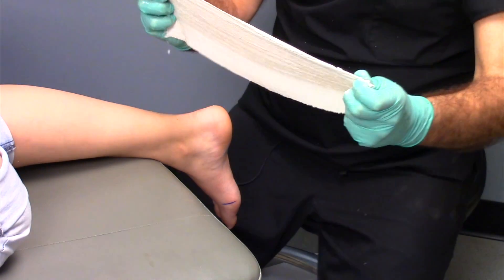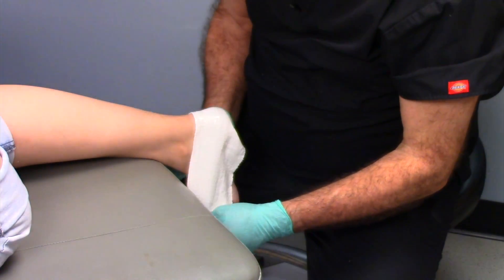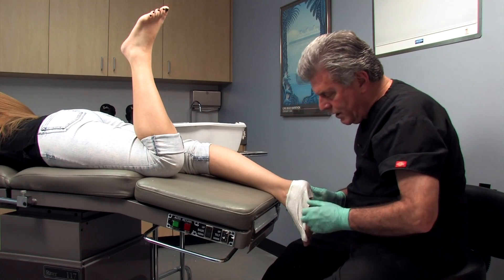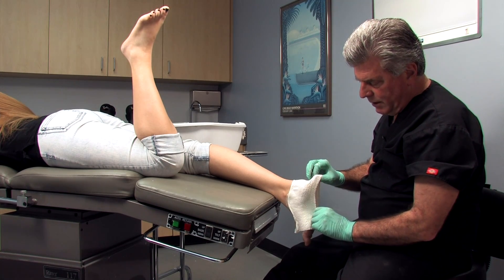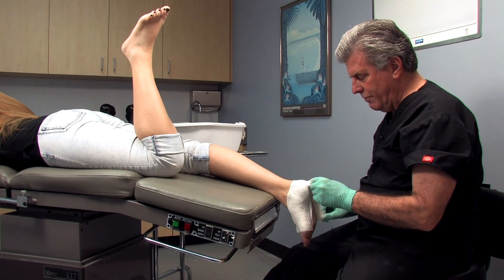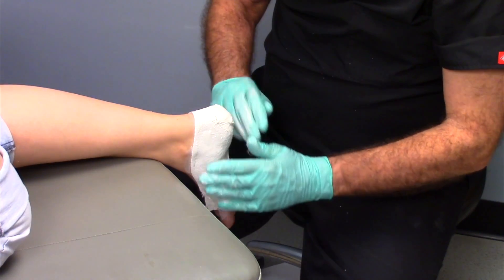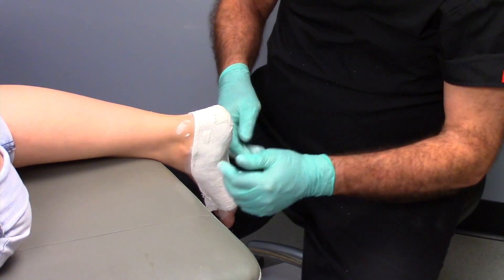We're going to rub that in a little before we place it on the foot, then go ahead and hem it slightly at the top. We place this around the back of the calcaneus, just under the malleoli, to get a deep heel cup. We lift and pull that into the arch and smooth it in — no wrinkling. We bring the lateral flap over, overlap the medial flap, and bring the plaster back up onto the back of the heel, not the bottom of the heel.